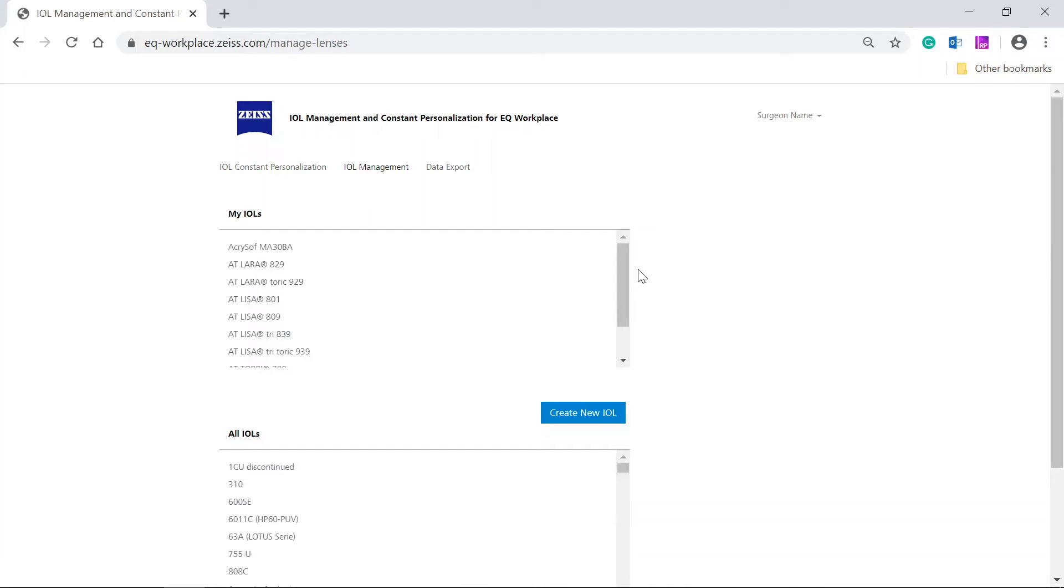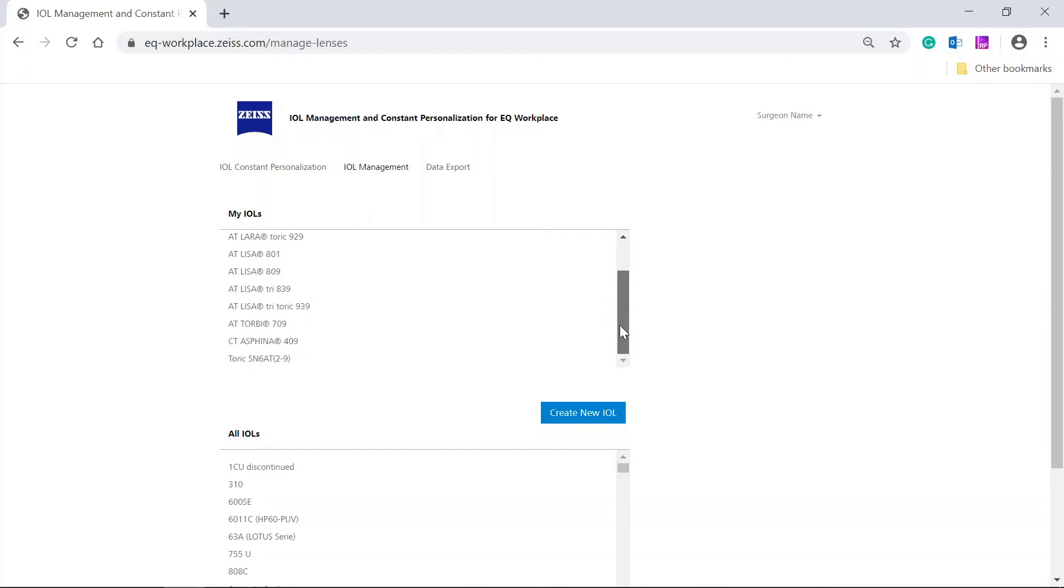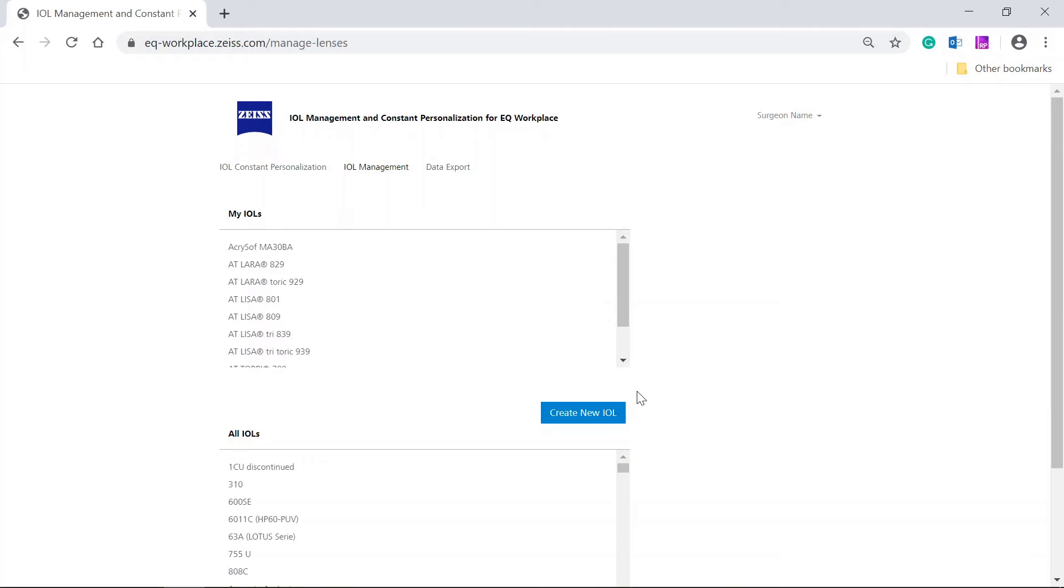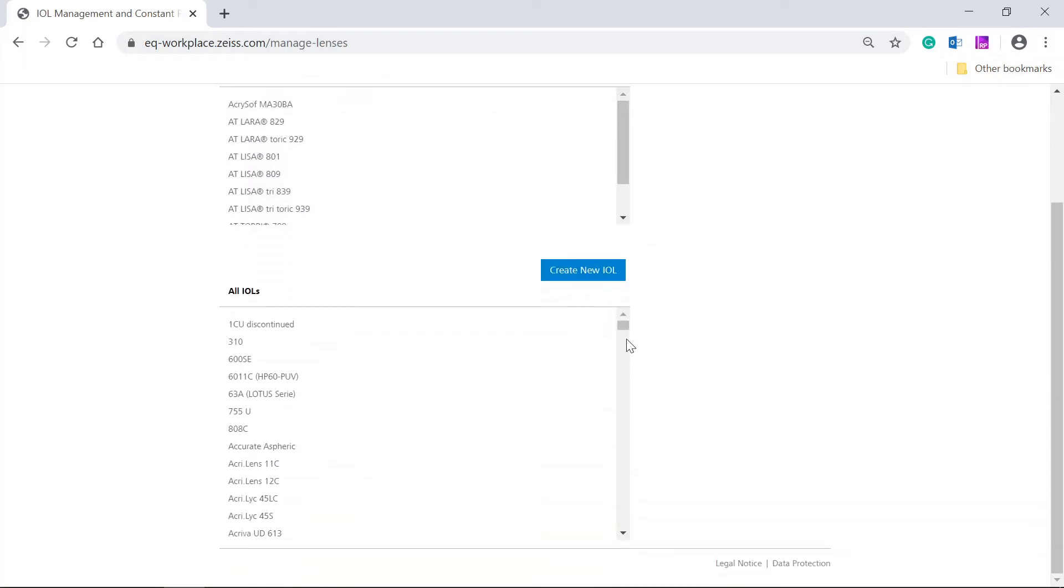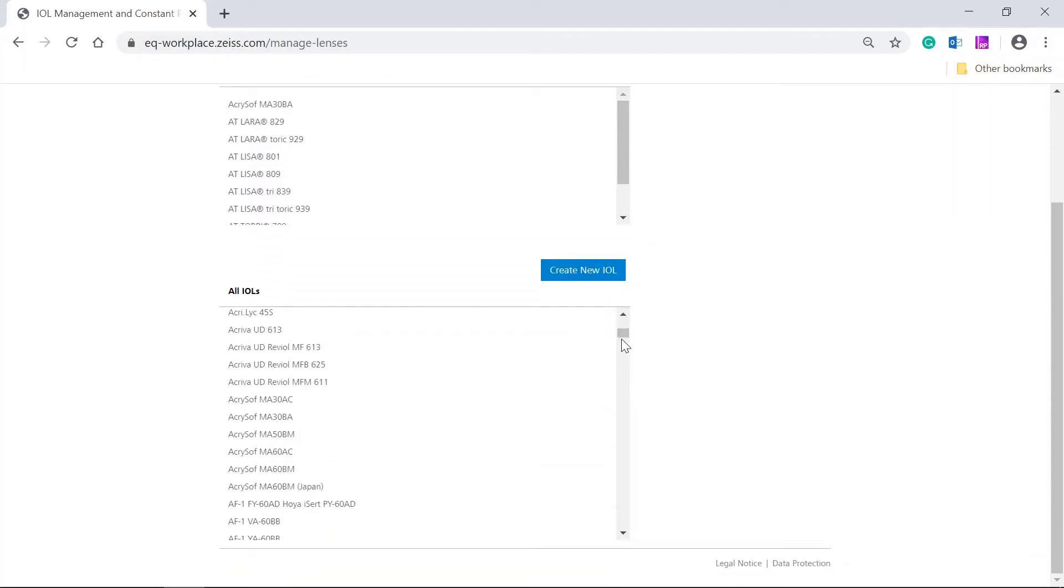In the upper table, your personal IOLs are displayed. A list with IOLs available in the system database is displayed below.